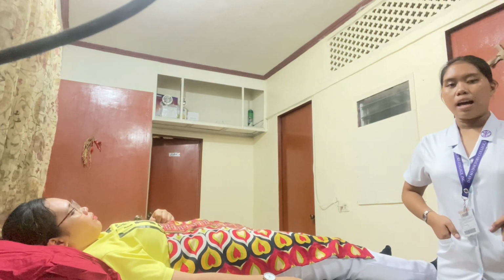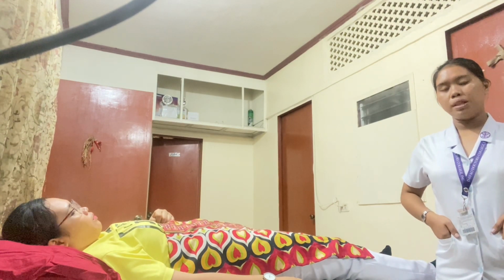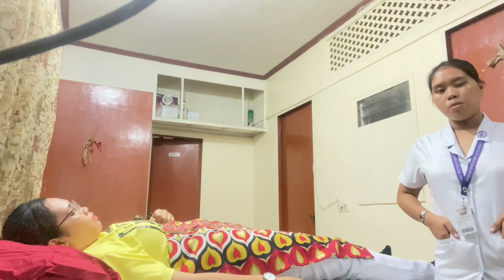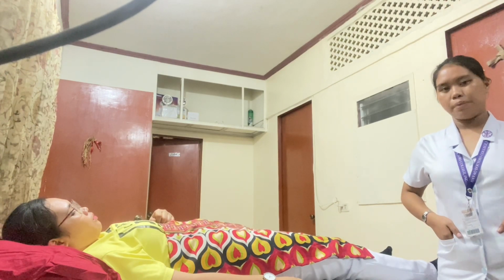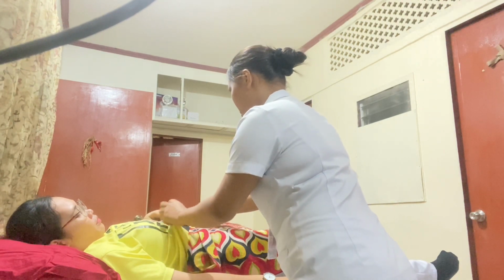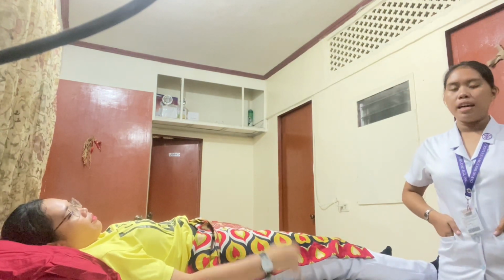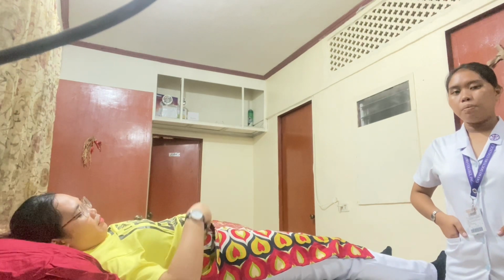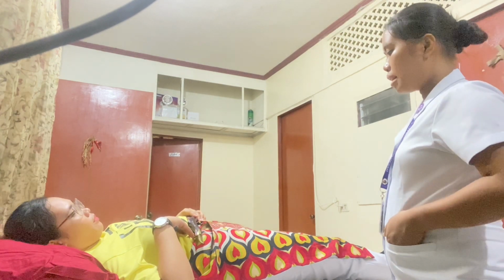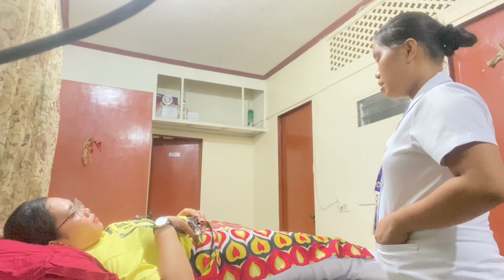And now, assist the client so that the abdomen can be relaxed. This is to minimize discomfort. And also, obtain assistance for keeping the client still to prevent injury. Then after that, explain the procedure to the patient so the patient knows what medication you will give to her. So now, ma'am, I'm going to do the subcutaneous injection, which is I'm going to inject you into your abdomen. Is it okay with you, ma'am?